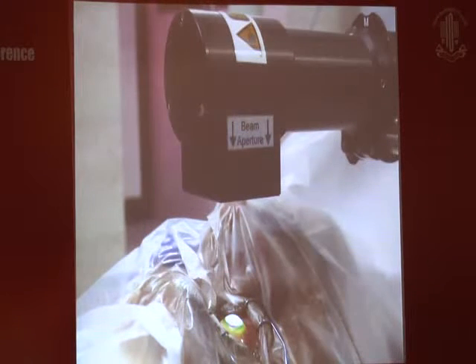And just for nomenclature, today we call the epi-on procedure C3R and the more commonly performed epi-off procedure CXL. Another variation is the use of riboflavin without the dextran, and this so-called hypotonic riboflavin allows you to treat corneas thinner than 400 microns up to a thickness of 350 microns, because with the standard riboflavin we generally will only treat corneas thicker than 400 microns.